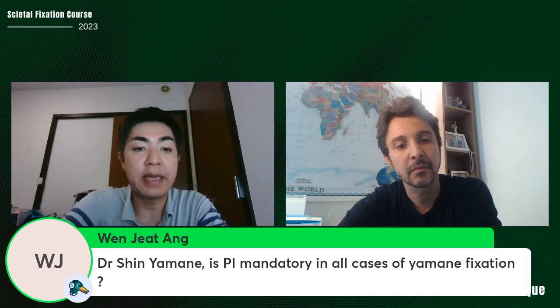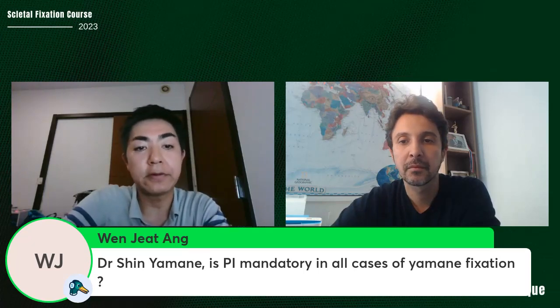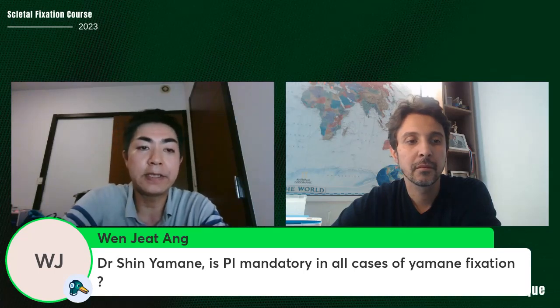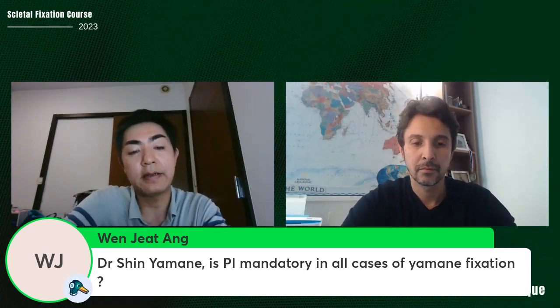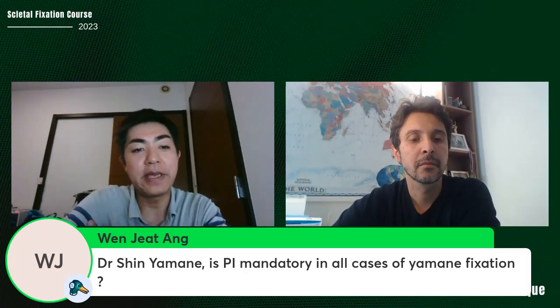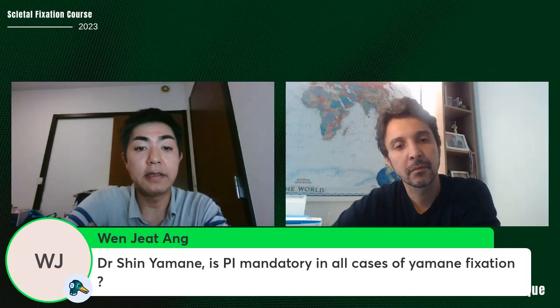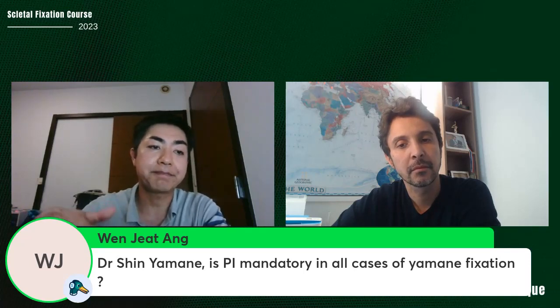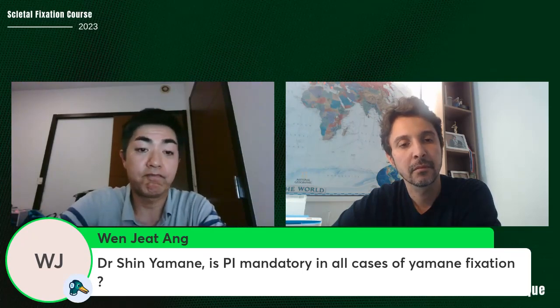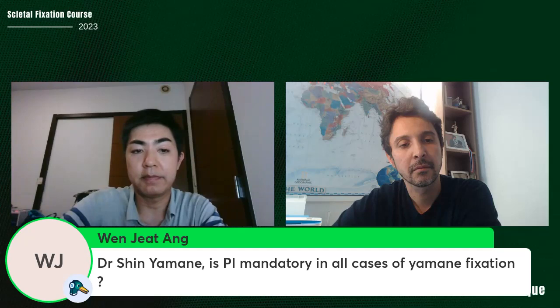I personally make PI in almost all cases. But some doctors don't make PI, and they said that's no problem. So I don't know which is better. But for me, it's nothing to make PI. And PI can avoid the pupillary block, reversed pupillary block. So I make it in most cases.